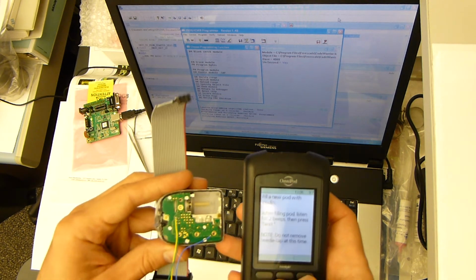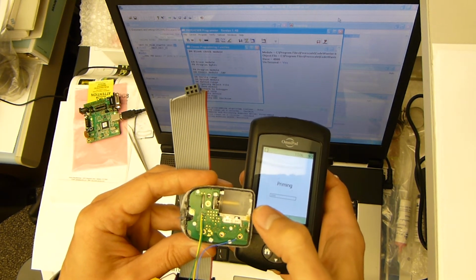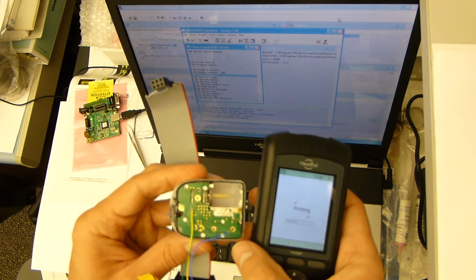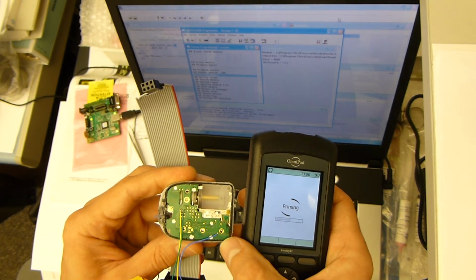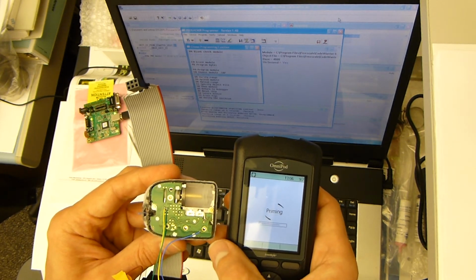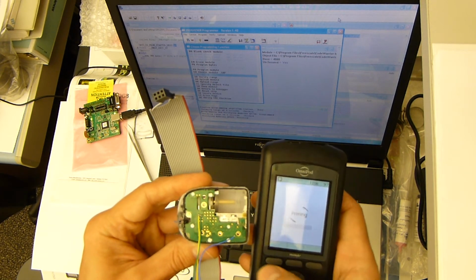Right, let's go next. Okay, the PDM goes into priming and you can see that the gears inside the pod start turning, so that means we are successful in the priming process. So we need to wait until the priming is finished. And at the end of the priming process, the PDM and the pod are linked together so that they can securely communicate with each other. So a few more seconds to finish the priming. So now the gears stop turning and you can see a few drops of insulin pushed out of the tank.